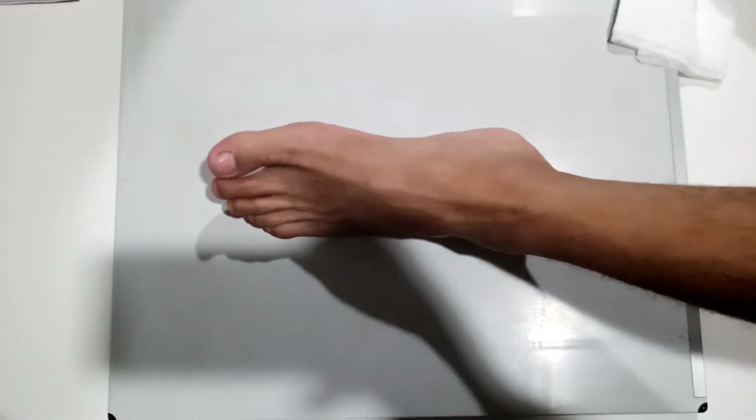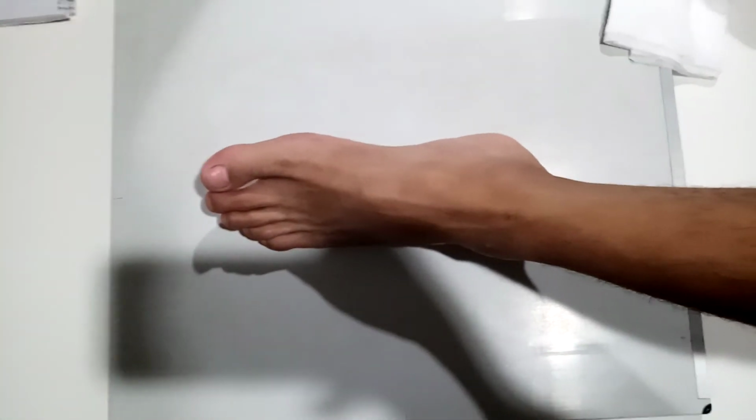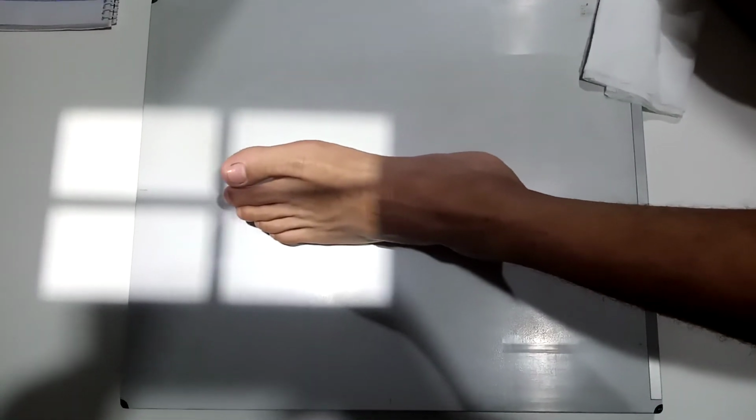Next, the central ray must be perpendicular and centered to the base of the third metatarsal. Third metatarsal. At the base of the third metatarsal. Then collimate.